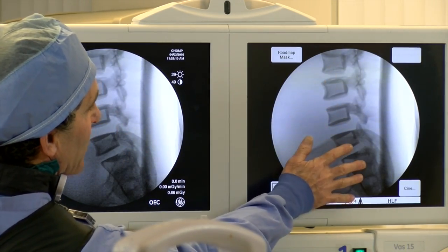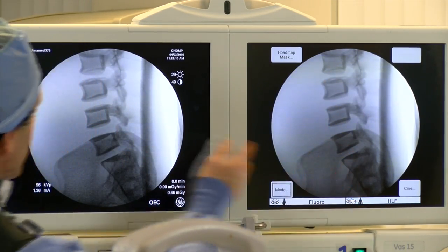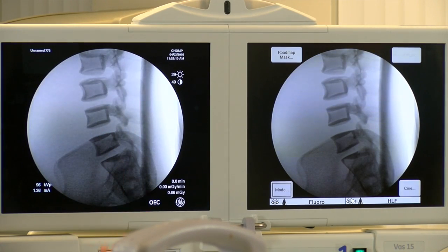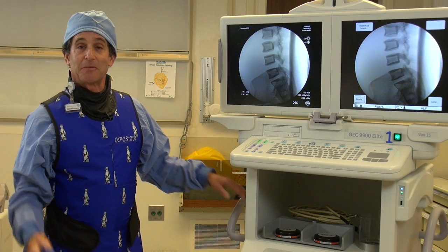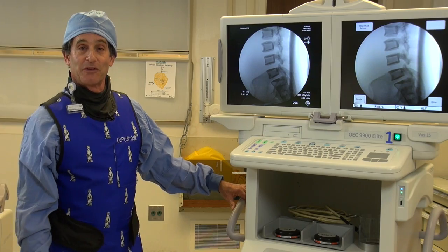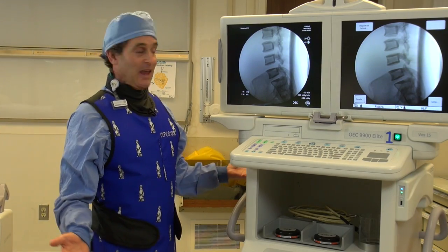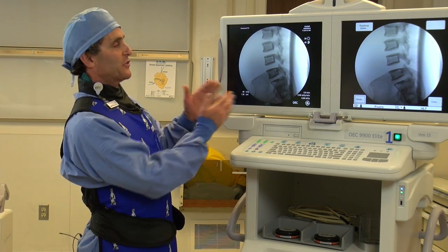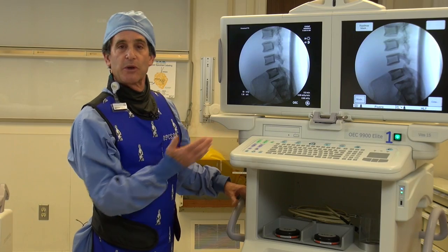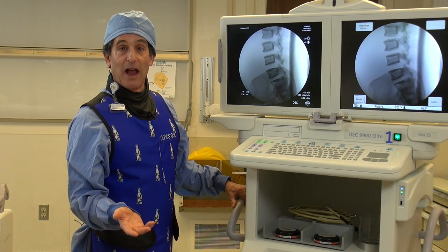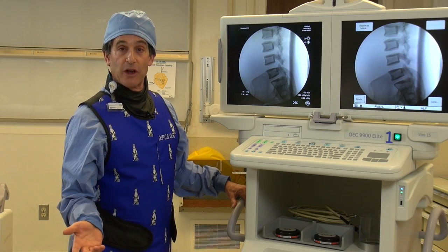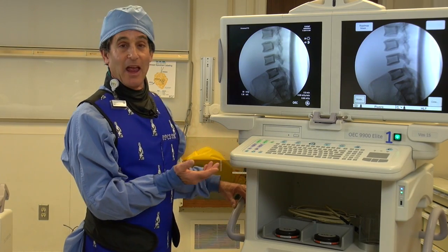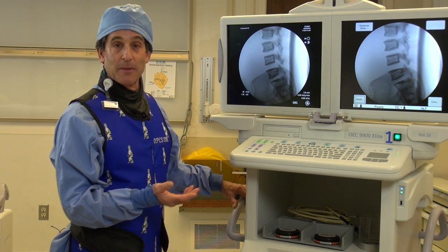Everything about the default image is smoother. This low-dose one just has mottle. Does it have too much mottle? Well, that of course is always up to whoever is the doctor doing the case with you. But that's one you would always want to ask about when you go to low-dose, because again, you're using half of the mA.